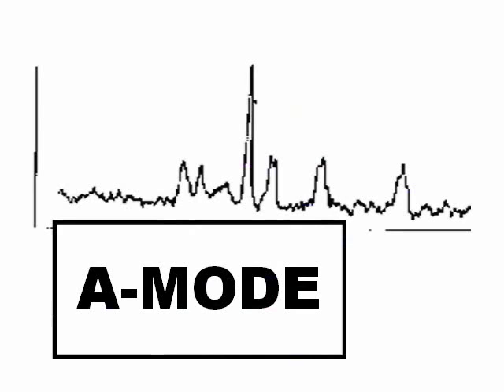A mode. A mode is the most crude, the least computerized form of ultrasound. In A mode, the machine displays the amplitude of the echo directly. The use is only in ophthalmology, ophthalmologic ultrasound. This is a very limited use, it is not in general sonography. A mode are the echoes, the amplitudes of the echoes directly registered in one line.